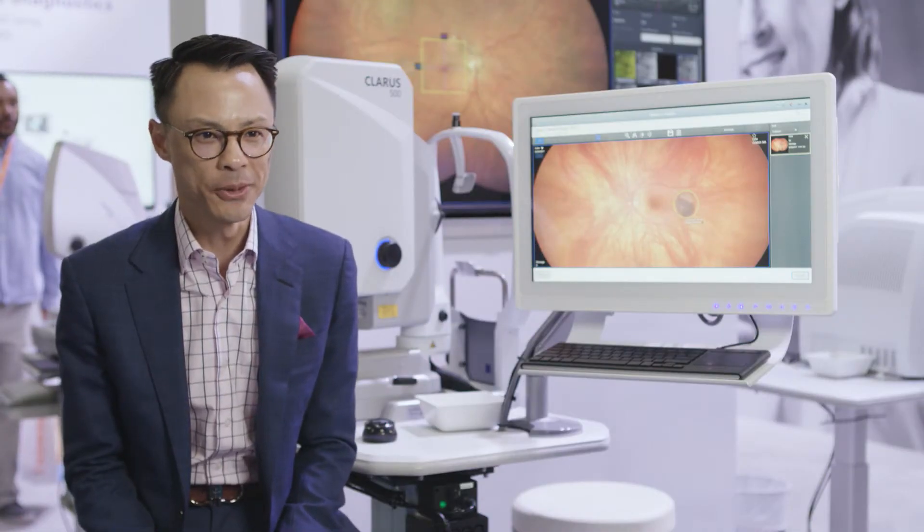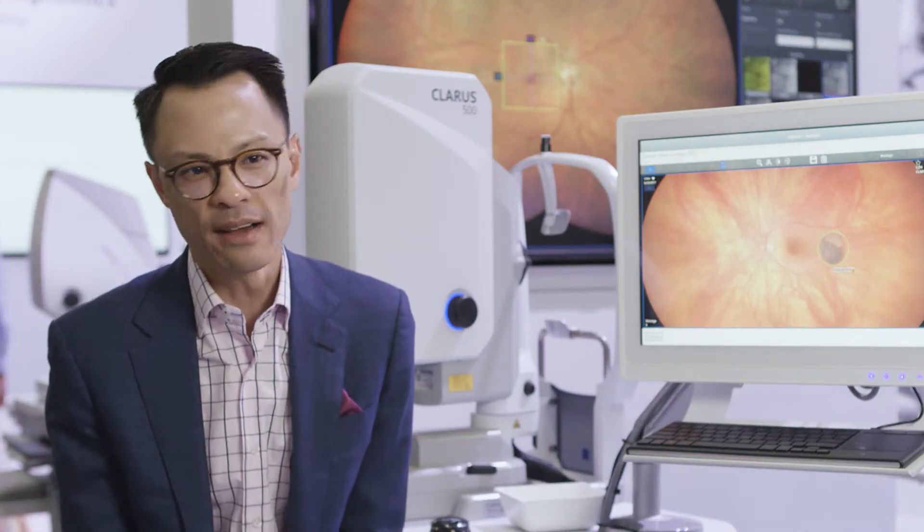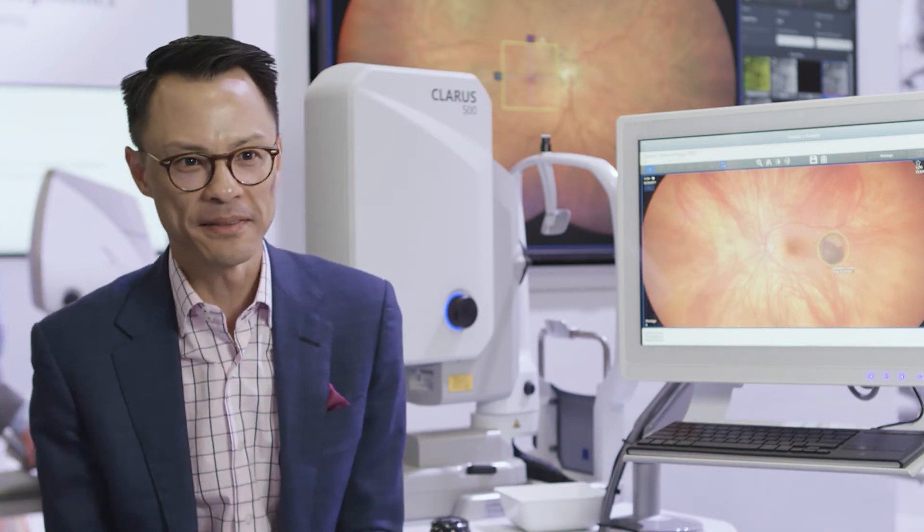As a patient education tool, not a single day passes where I have at least 2 or 3 patients that thank me for allowing them to see the back of their eye.